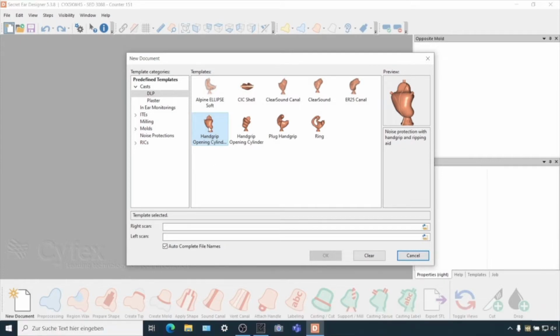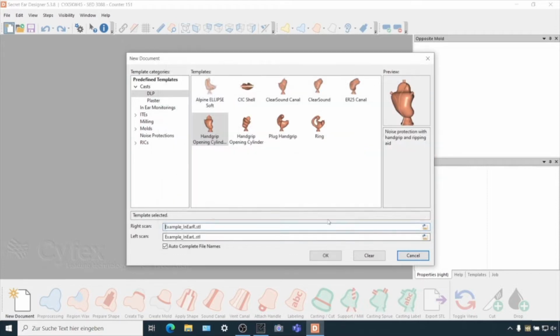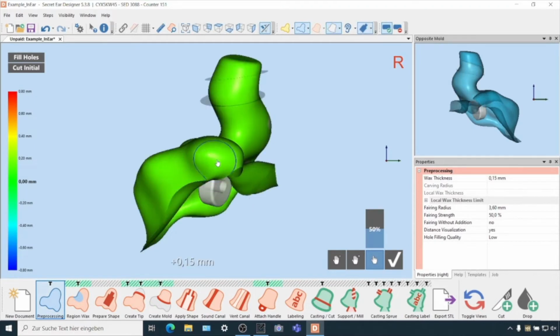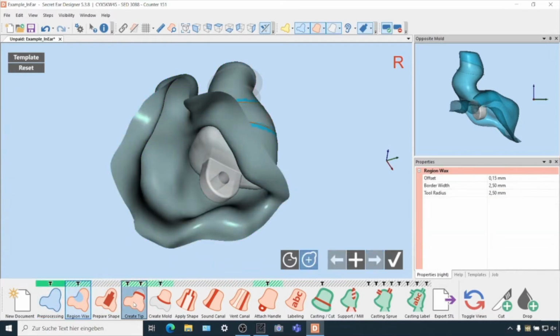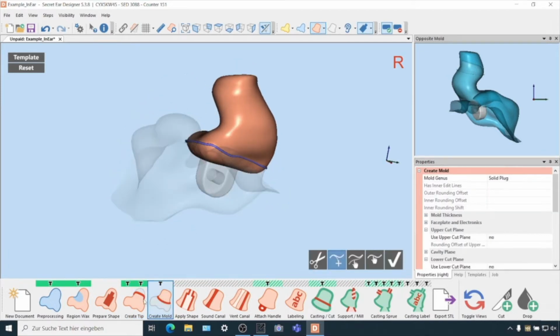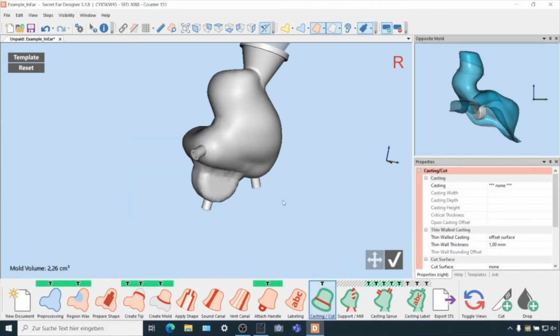So the easiest way for us is to select the hand grip, opening cylinder. We need to select here some sample files. In this case, left and right is fine. We open it, and now we can see in this ear designer our digital impression. And also we can see here inside the object we will model. So as I said, it is not a modeling workshop, so I will jump over the first steps. And for sure, as you know, it is not perfectly cut here. The direction to the eardrum is not perfect, but in this case, we will talk about the casting.